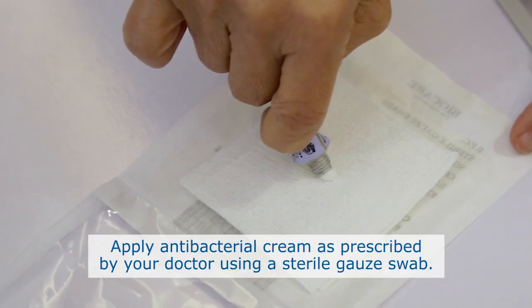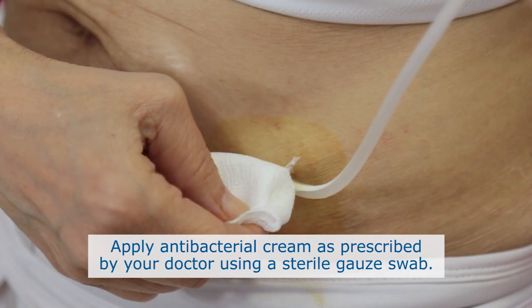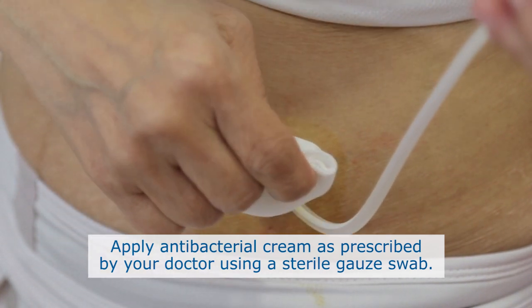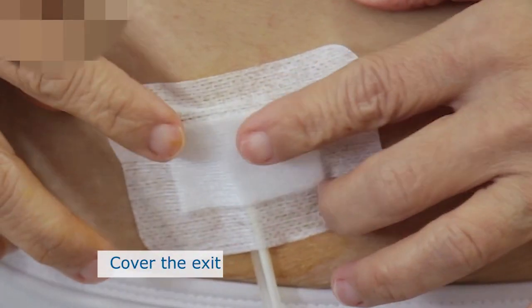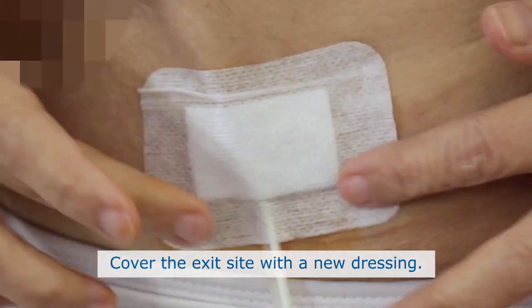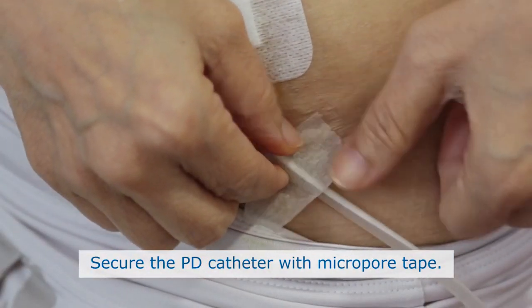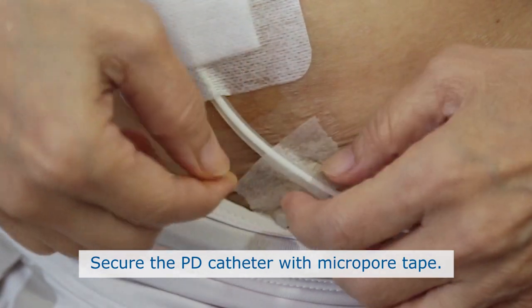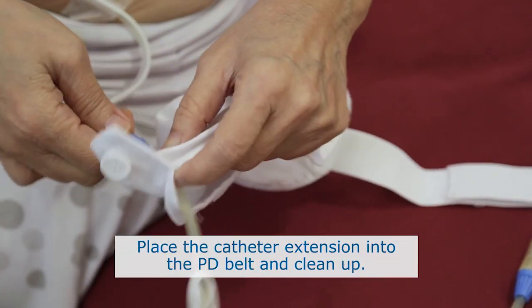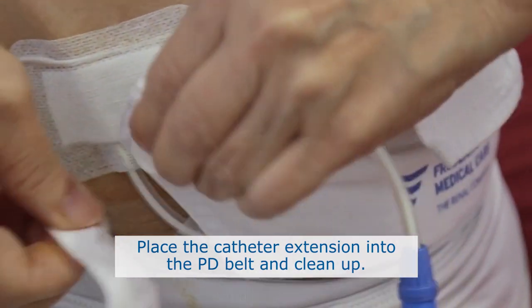Apply anti-bacterial cream as prescribed by your doctor using a sterile gauze swab. Cover your exit site with a new dressing. Secure your PD catheter with micropore tape. Place the catheter extension into your PD belt and clean up.